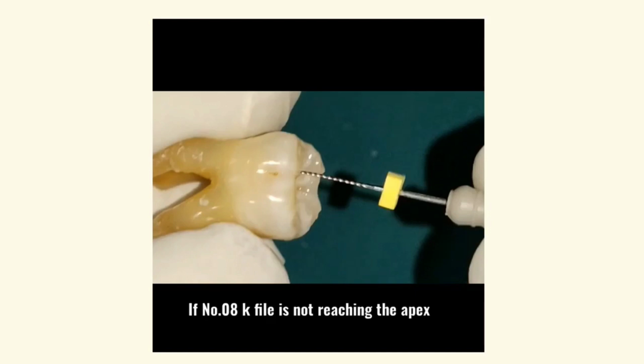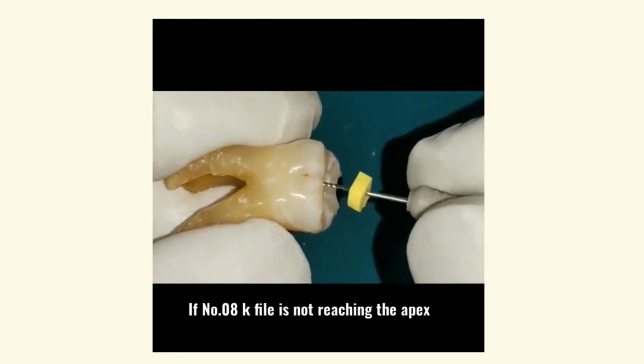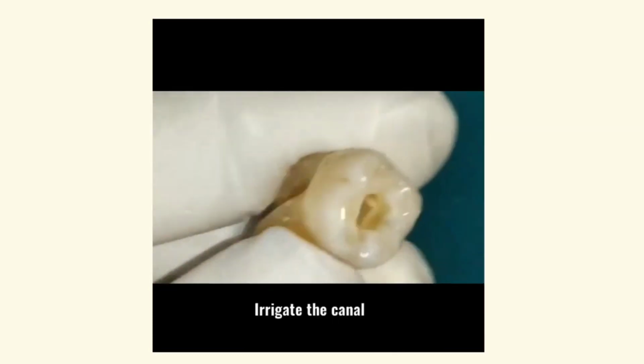Now in some cases, even the number 8K file is not reaching the radiographic terminus with all the above techniques. That means you are in a really tight or constricted canal. In that case, don't force or screw the file in the canal; the following protocol is followed. This is a small video demonstrating what to do when your number 8K file is not reaching the apex.